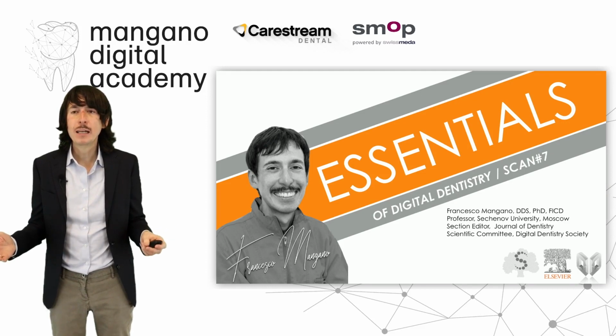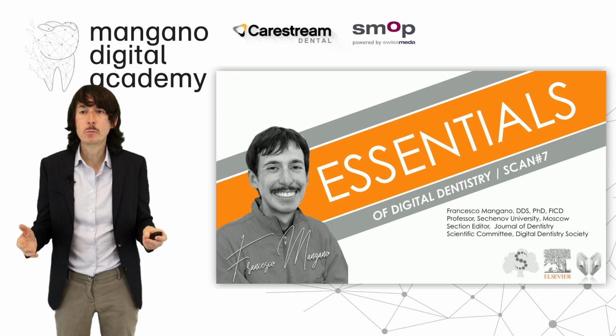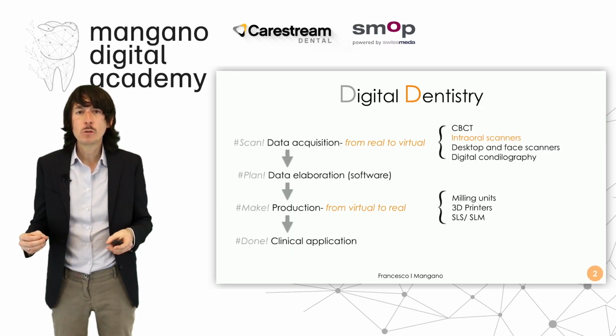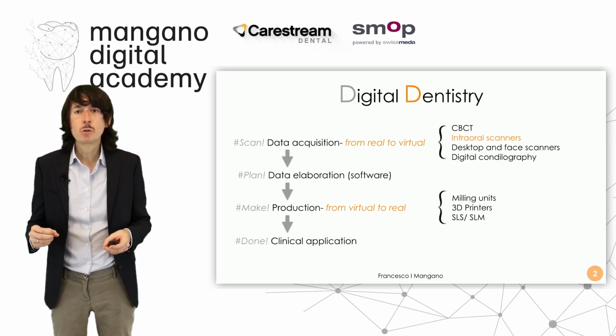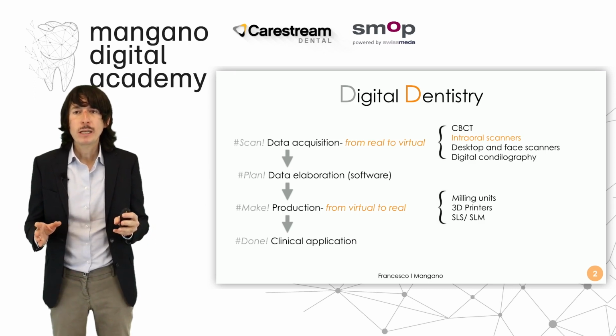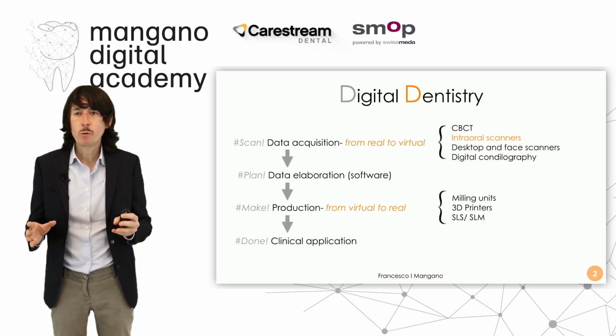In this short lecture, we will talk about the intraoral scanner, and in particular we talk about precision. It's quite important to remember how the workflow goes in digital dentistry, because we have a scan phase for the 3D data acquisition. We go from the real world to the virtual world, and we capture three-dimensional information of our patient, the tissue of our patient, by means of cone beam computed tomography, in order to capture the hard tissues, particularly bone, but also, of course, the teeth.